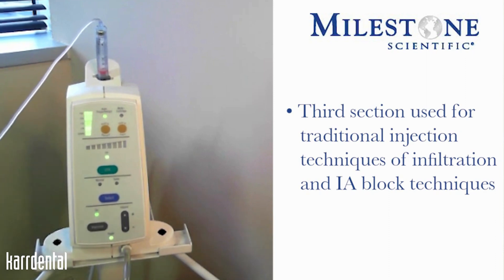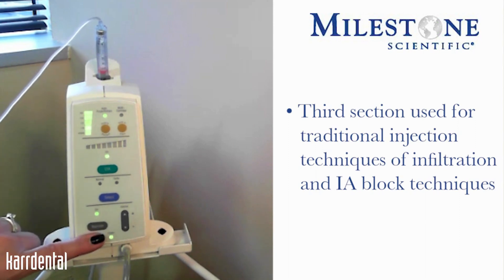Turbo is only to be used if you are using multiple carpules of anesthetic on a particular patient for a particular procedure. Turbo will be used with those additional anesthetic carpules. You'll see the aspiration light lit, meaning that as soon as you stop the flow of anesthetic, the instrument will automatically aspirate for you.